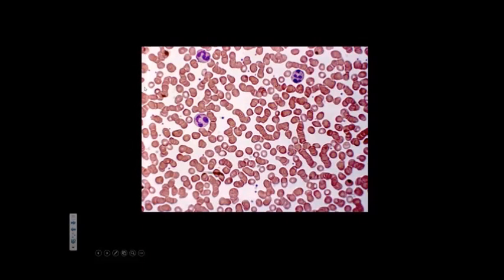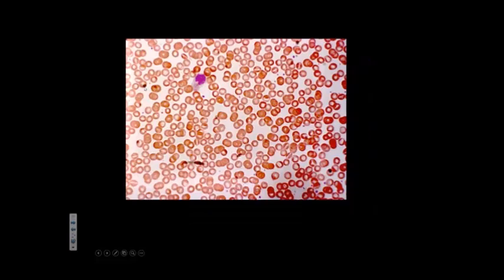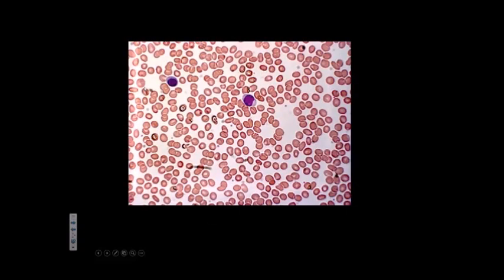Okay, what do we have here? Three neutrophils. Five. Okay, what do we got there? Monocyte. Yeah. What's there? It's probably just artifact. They're drying up. Okay. Probably just artifact.